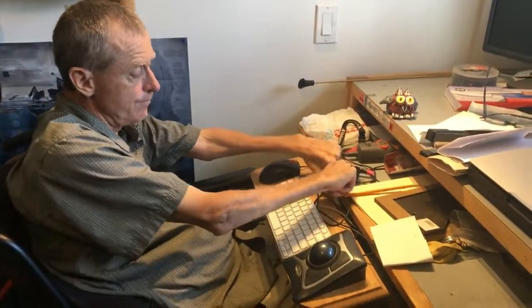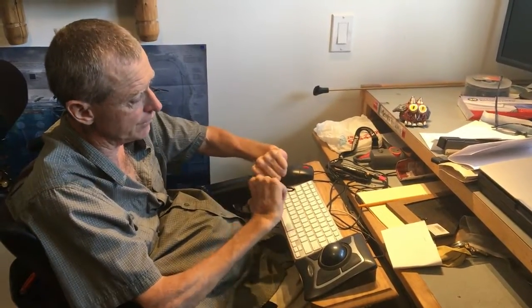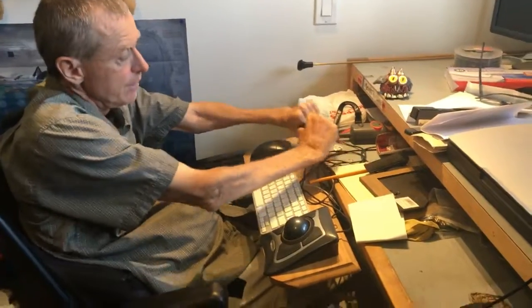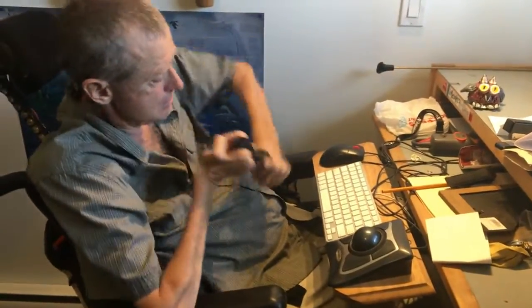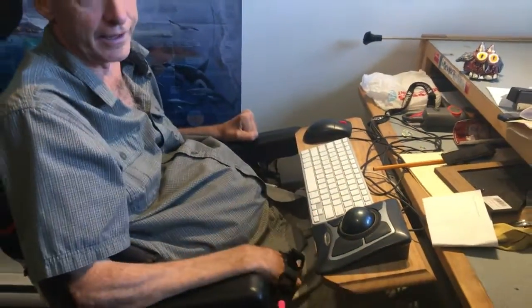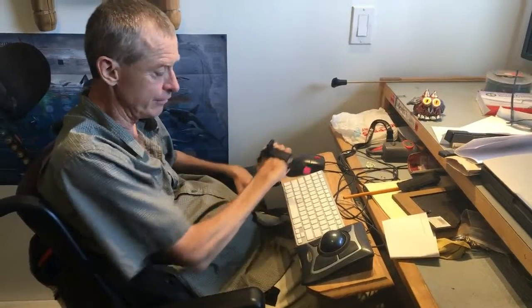And to use the keyboard, once again, another little Velcro cuffy thing. And there's a sleeve on this one. And you can just drop a pencil into the sleeve, cut it to whatever length you want. And basically it ends up looking like this. And so I can just go type, type, type. And it works pretty good. I don't type a lot, just a couple sentences here and there. But it works well, and every so often I'll flip the trackball over to this side and the other mouse over to this side, and it helps the shoulders recuperate here and there. And that's it for computers.